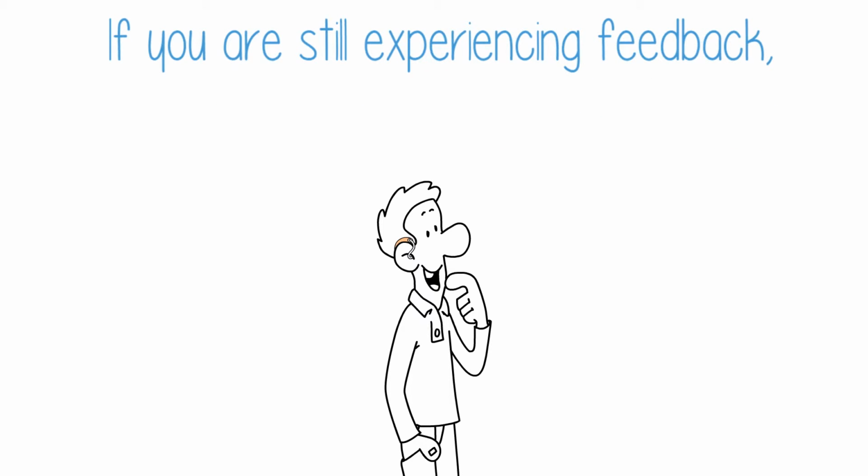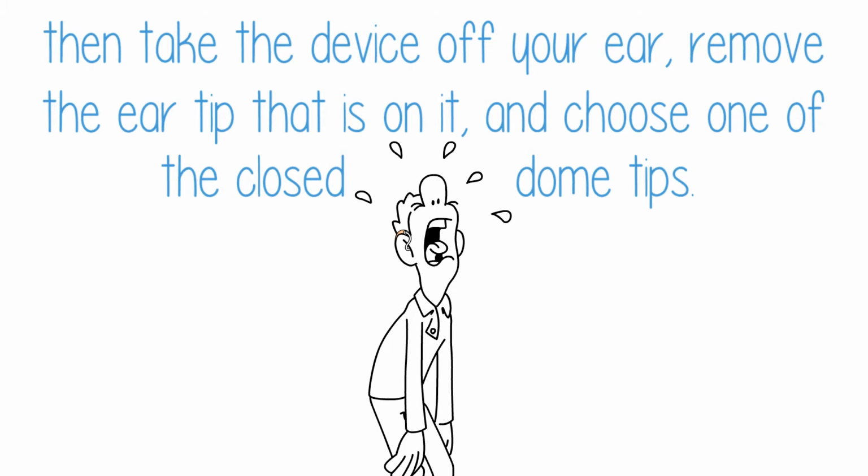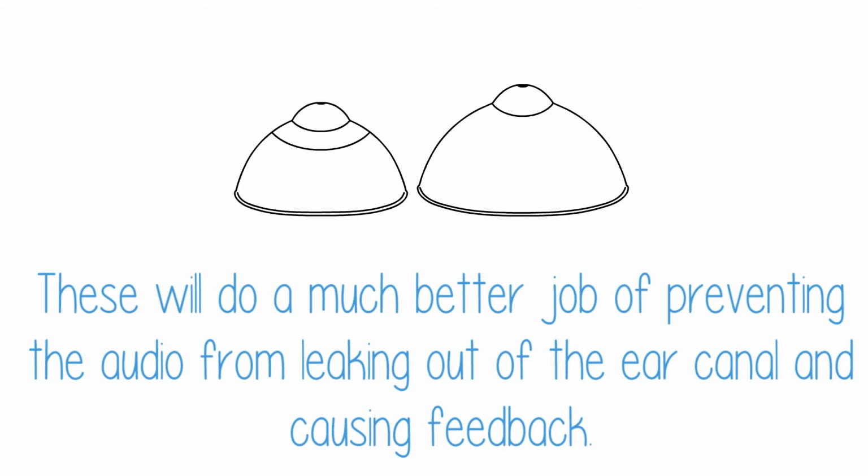If you are still experiencing feedback, take the device off your ear, remove the ear tip that is on it, and choose one of the closed dome tips. These will do a much better job of preventing the audio from leaking out of the ear canal and causing feedback.